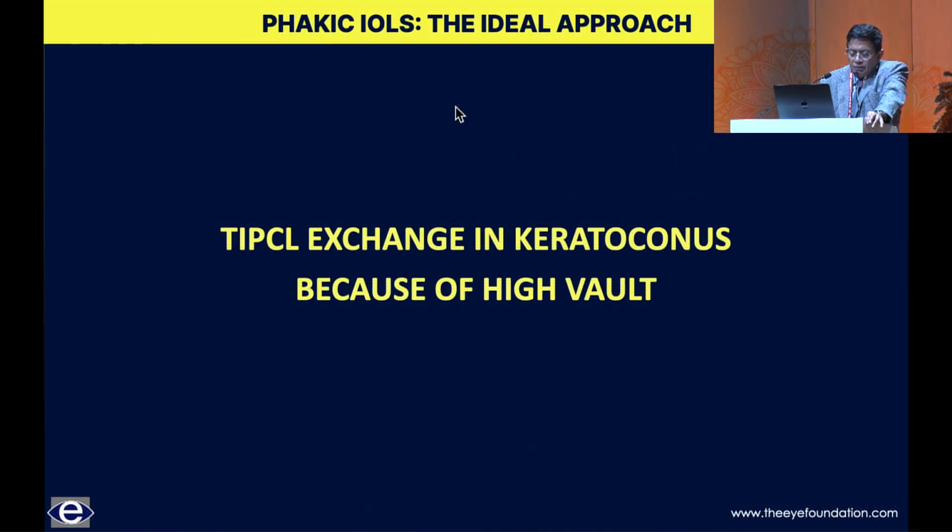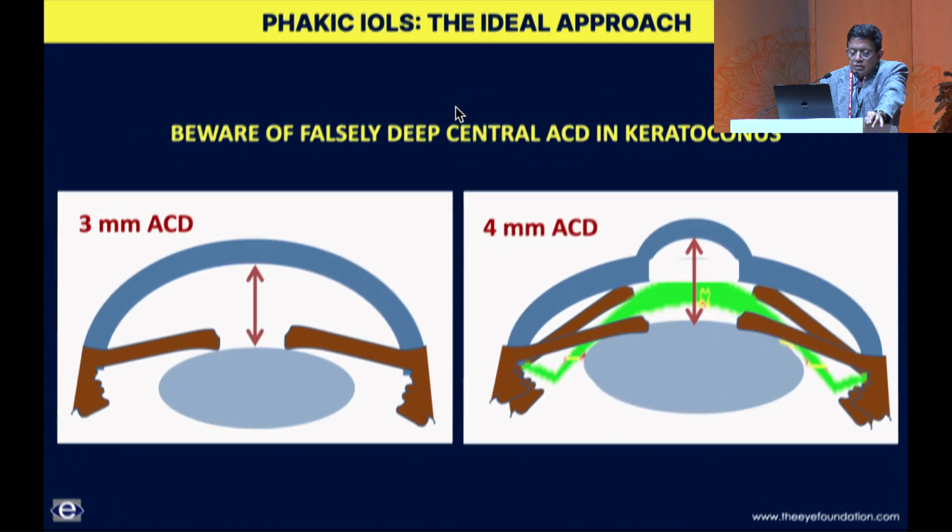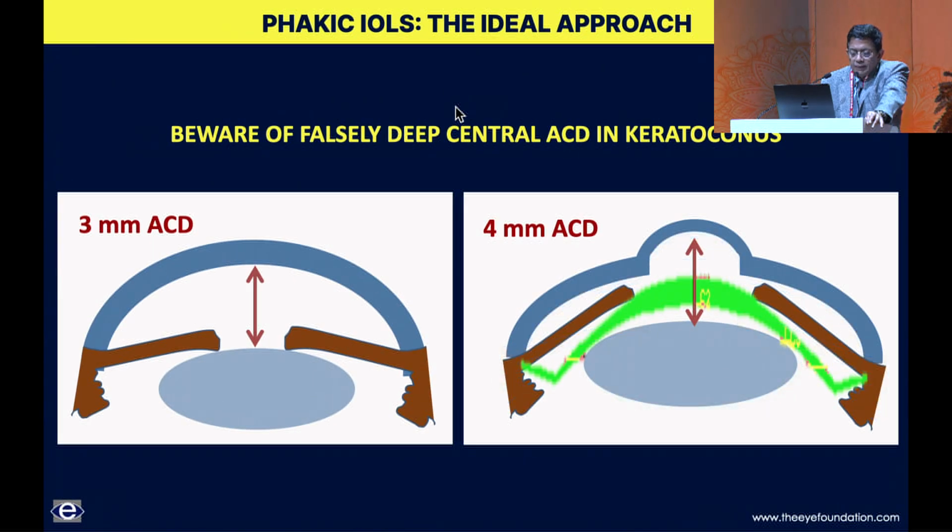And whenever you're doing keratoconus, there can be chances of lens being oversized, simply because if you are taking only the central AC depth, like in this case, and if you have a central cone, you could get the AC depth as much as 4 millimeters, but there can be peripheral crowding. It has been suggested you can get multiple readings from the periphery also, but then there's no algorithm that's available to size your lenses according to the measurements that are taken peripherally.